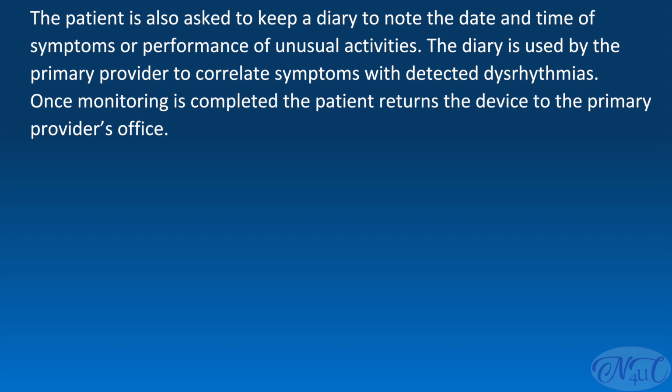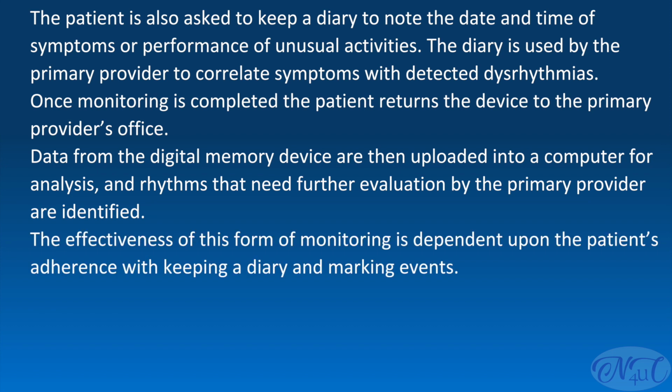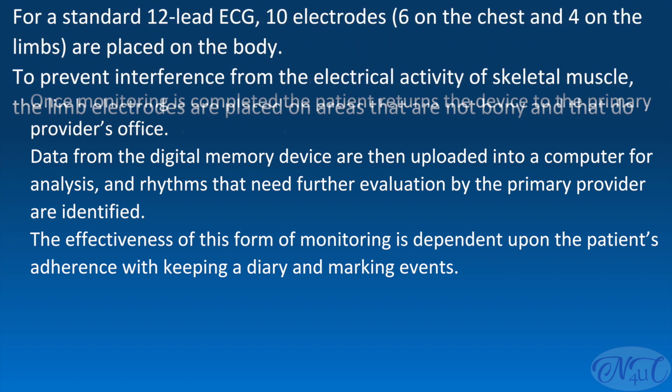Once monitoring is completed, the patient returns the device to the primary provider's office. Data from the digital memory device are then uploaded into a computer for analysis, and rhythms that need further evaluation by the primary provider are identified. The effectiveness of this form of monitoring is dependent upon the patient's adherence with keeping a diary and marking events.